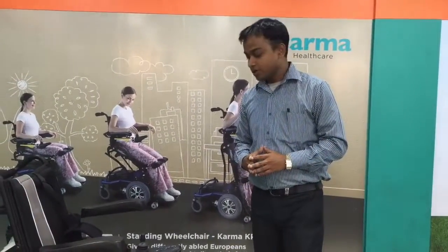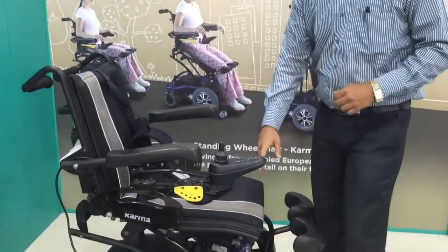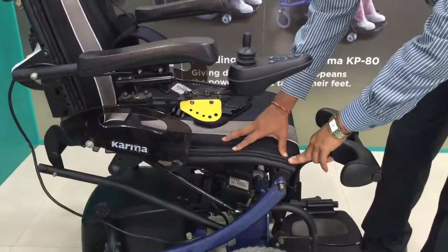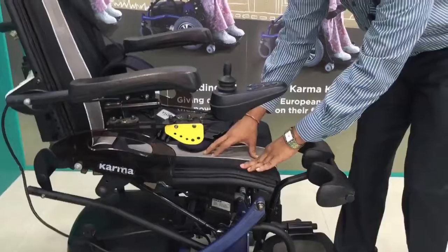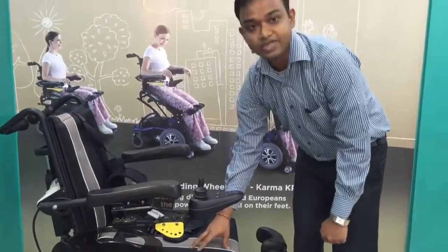As I mentioned earlier, the KP80 comes in an SRBO series. SRBO stands for the S-curve, which is specially designed by Karma — it's a patented design. Due to this S-curve, your total body pressure will be distributed so that it gives you better wheeling, and you can sit on this wheelchair for a long time.